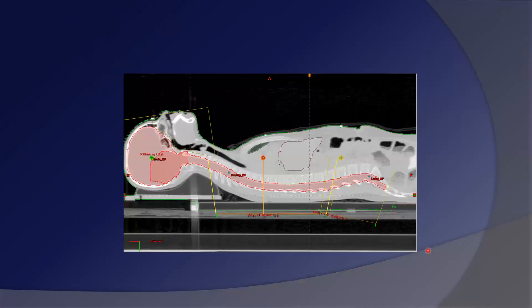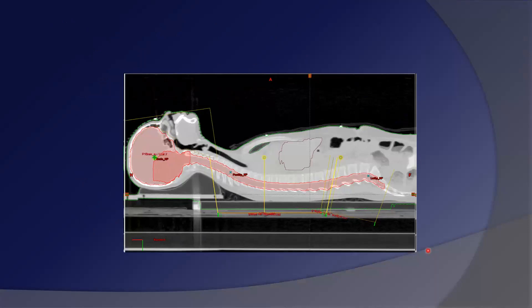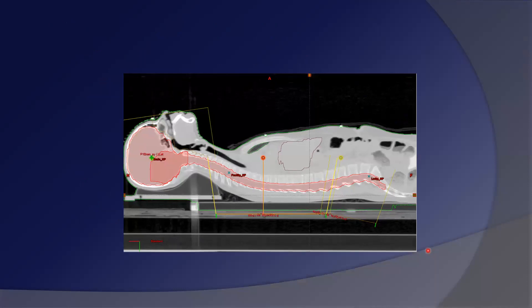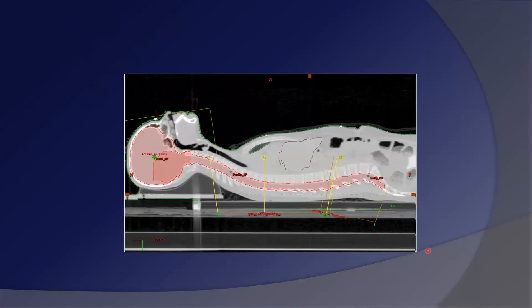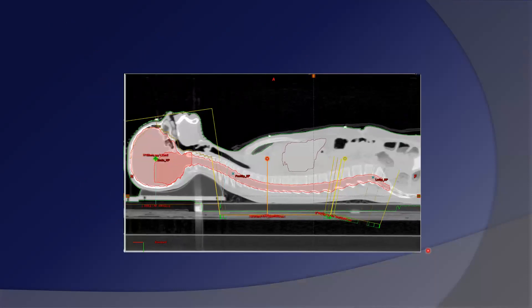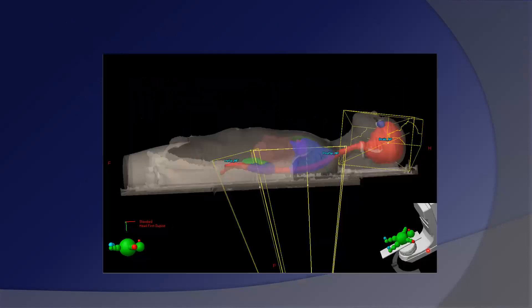Here you can see the sagittal view and the movement of the MLCs, as well as the beam's eye view.